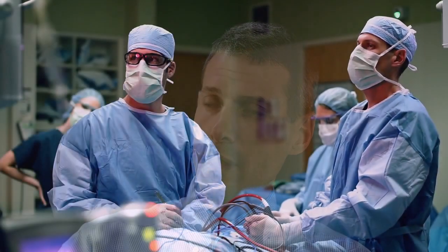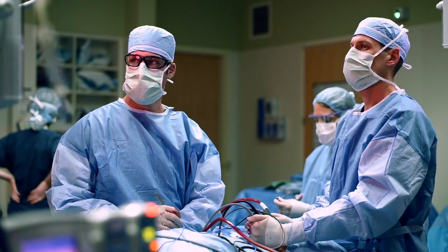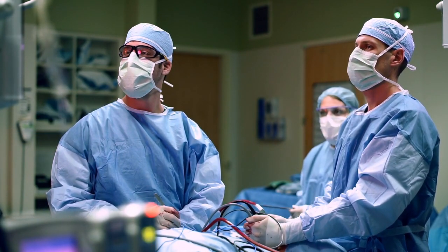VATS is basically like laparoscopy of the chest, comparing it to traditional thoracotomies which have a larger incision spreading the ribs to get inside and directly visualize the surgical field. VATS makes a very small incision, about two centimeters, to put a small camera between the ribs. We also make two other small incisions, about an inch or two inches long, to fit very thin instruments between the ribs and accomplish the same surgical procedure endoscopically, using the camera to visualize rather than directly looking between the ribs.